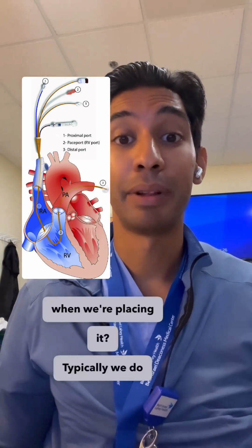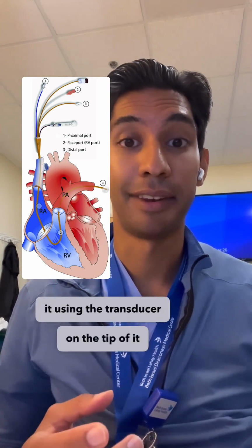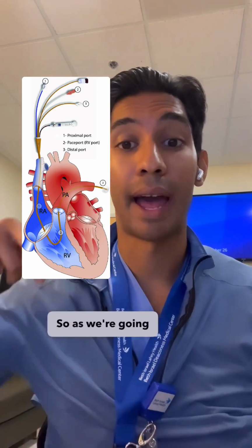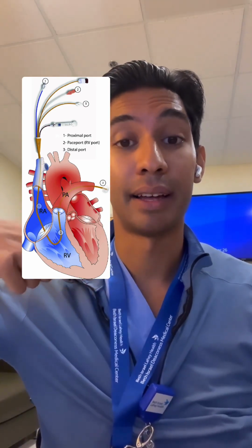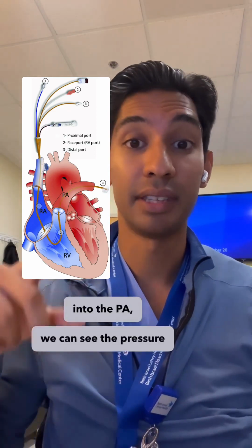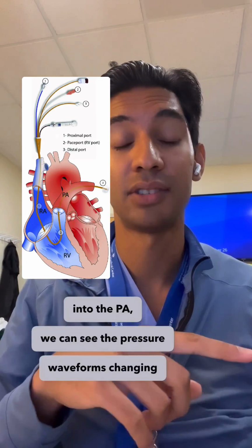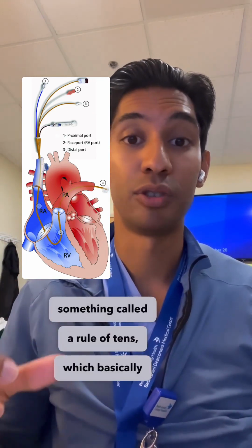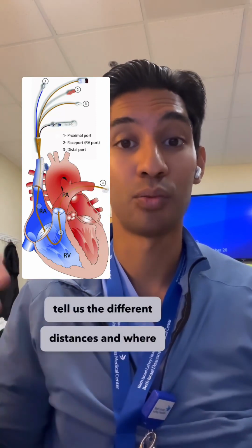Now, how do we know where we are in the body with this catheter when we're placing it? Typically, we do it using the transducer on the tip of it, so that tip of the catheter can basically tell us what pressure it's reading. So as we're going through the SVC into the right atrium, into the RV, and into the PA, we can see the pressure waveforms changing as we enter those different chambers. And also we have something called the rule of tens, which basically tells us the different distances and where we think we are in the heart.